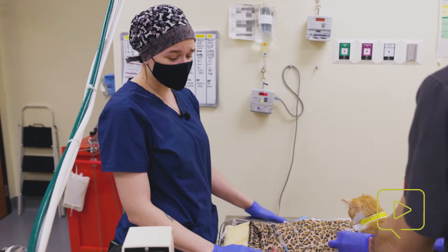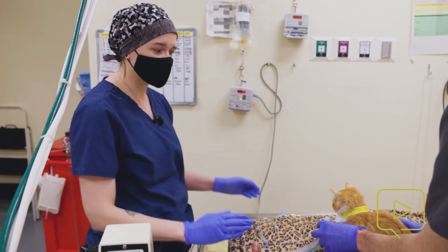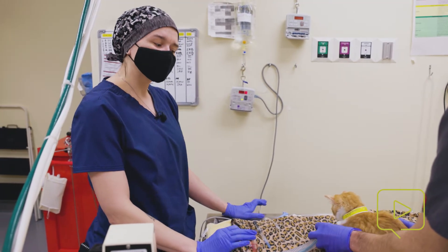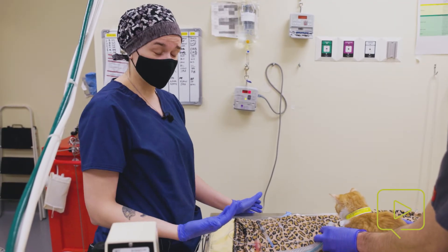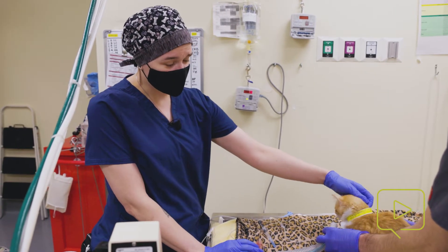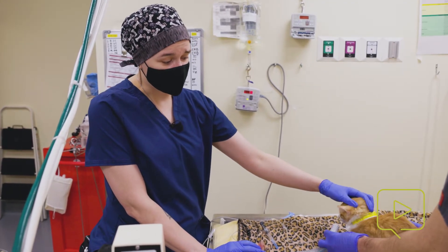So this is Chicken Strip. He's already had a couple of medications just to facilitate doing diagnostics and things like that, so he's a little bit sleepy. He will be getting a couple more medications to facilitate intubation. He is a very small guy — less than two kilograms.